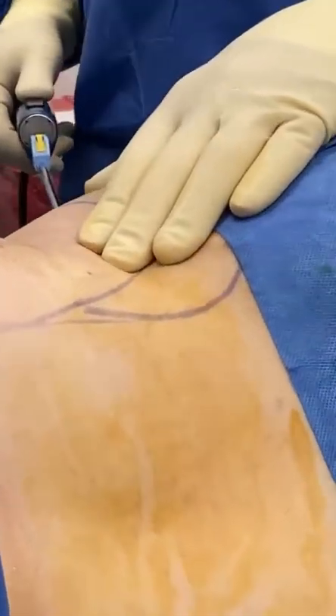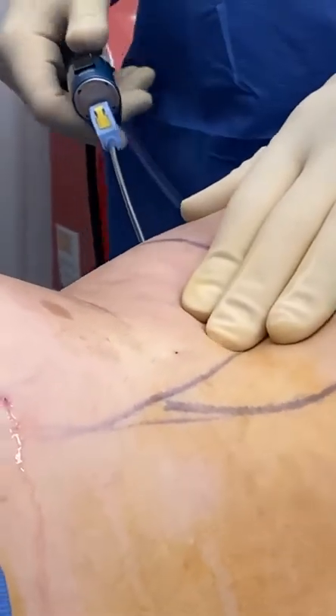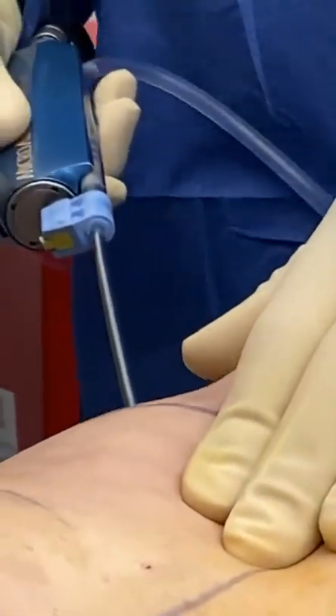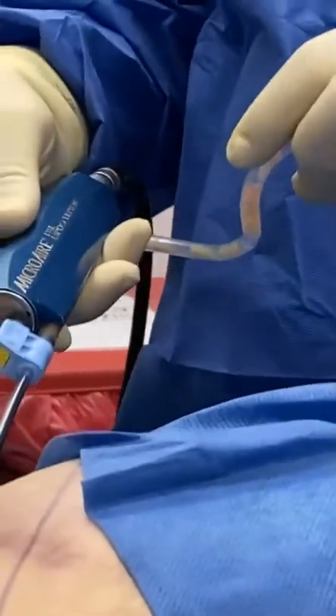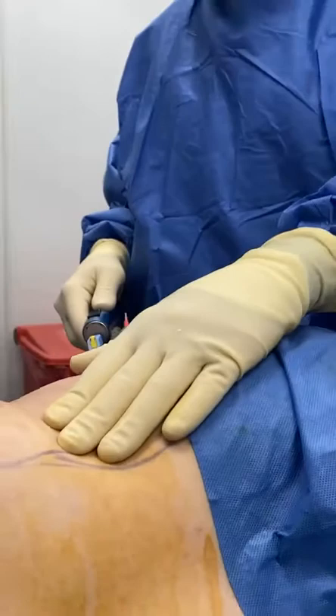Just kind of relaxing here, and you're going to be the first one to see what comes out. I can already see some yellow beautiful puffs coming out, and she's not having a bad transfer or anything. We don't want blood — we want this yellow beautiful aspirate here at the Cosmetic Surgery Center of Posterito.